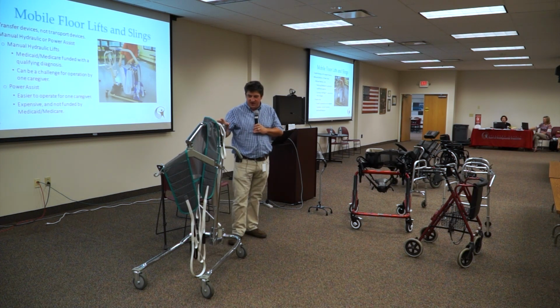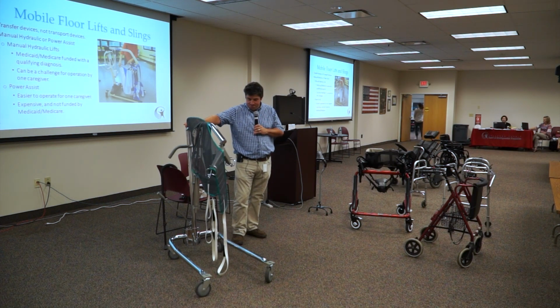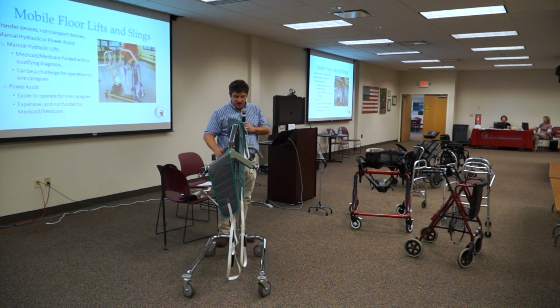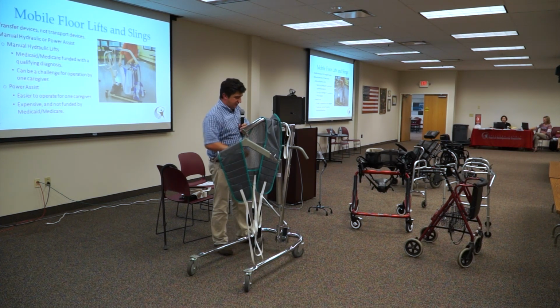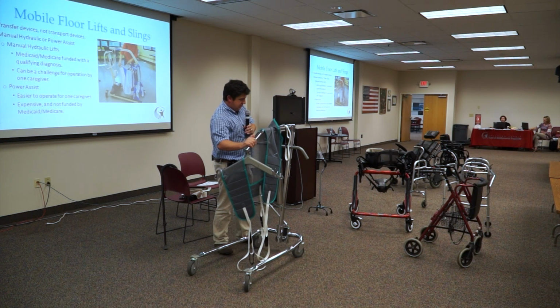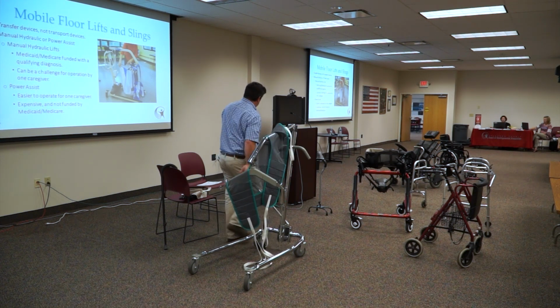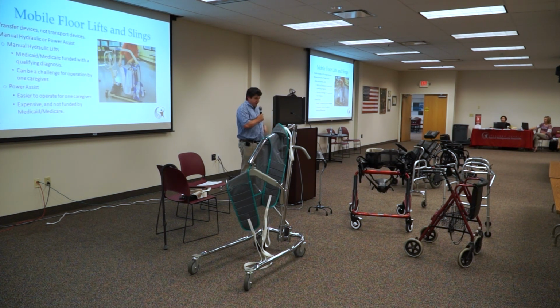The real benefit of this is that it's a covered lift for people with qualifying conditions, but it can be difficult to operate with one user because you're managing both the individual and the lift, having to pump it up, and then once you get to your surface, releasing the hydraulics so they can go back down. But doable, though again, you might recommend having two people to use it. Paul showed us earlier the powered floor lift. They're great, but also not covered, and they're quite costly.